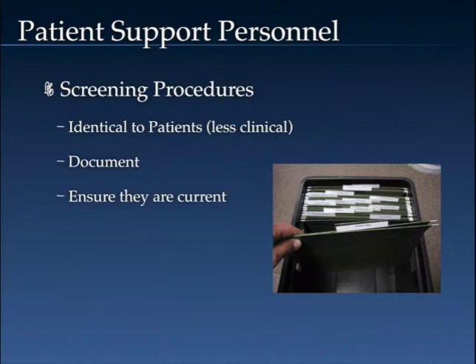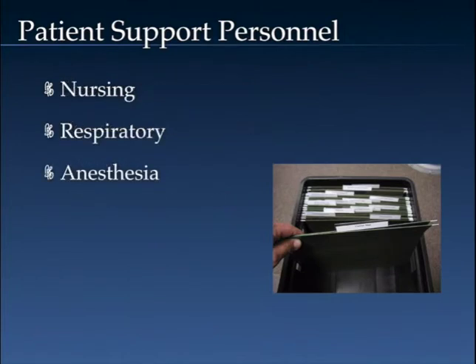If you have screening forms on file for these patient support non-MRI personnel, you need to ensure that they are current. It is a good idea, I believe, to have the person signing that document also sign that they understand they are to let someone know in MR anytime any of their medical information changes. And again, what I'm referring to here are nursing, respiratory, anesthesia. It is extremely important that these people be thoroughly screened, that you have documented screening forms on them that are thorough and complete and are indeed current.